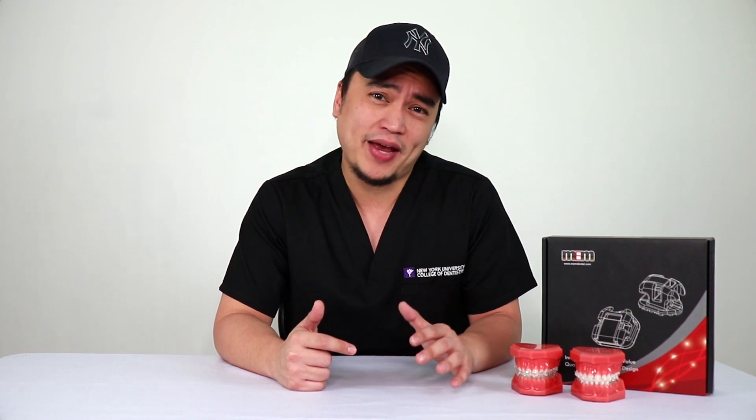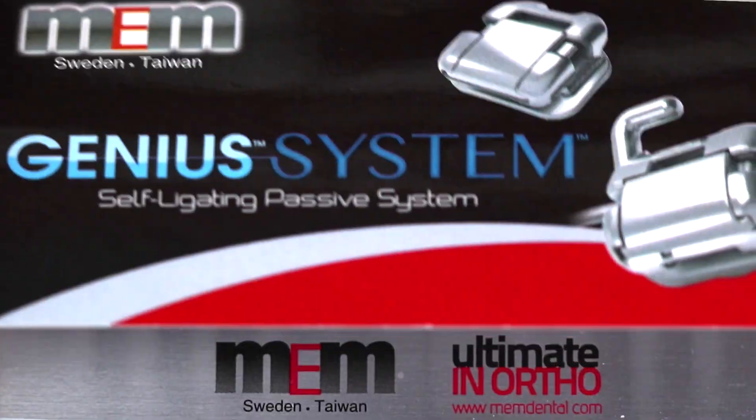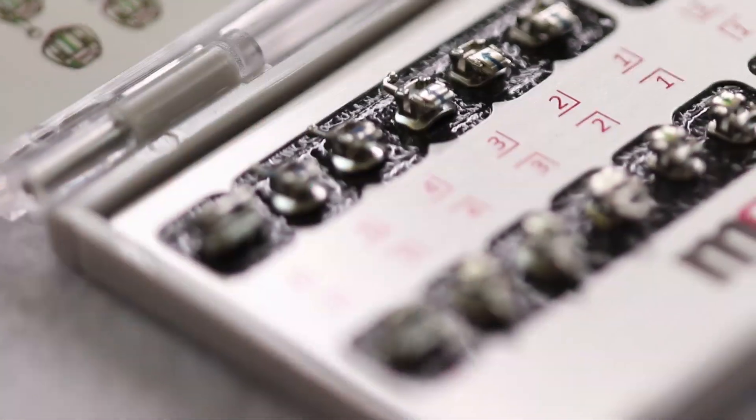The first thing that I love about this system is the fact that the identification makes it so easy. My assistants set it up for me, and when they hand it to me, the markers make it so easy for me to tell which is up, down, left, and right.